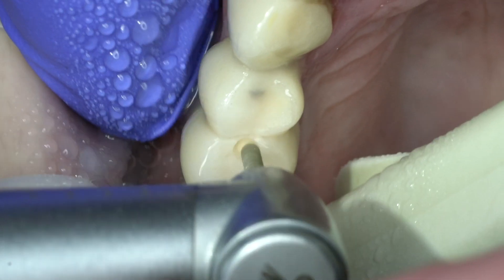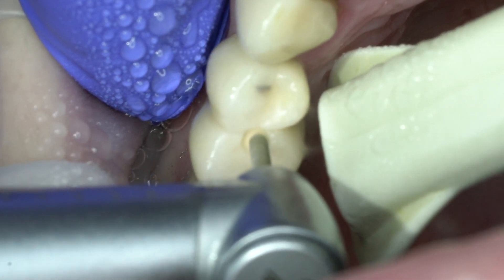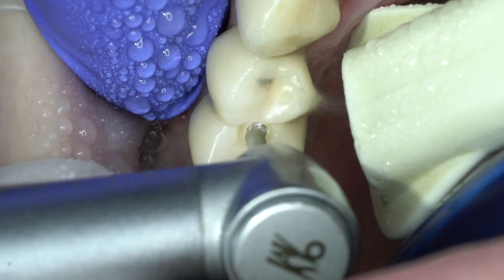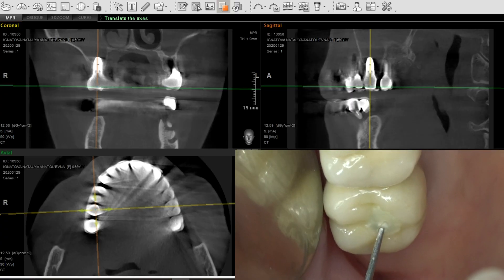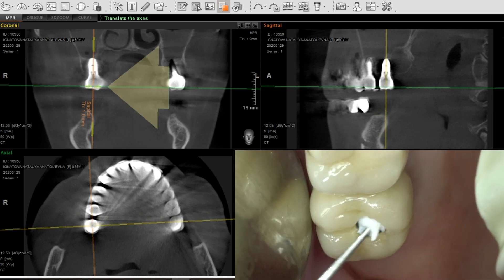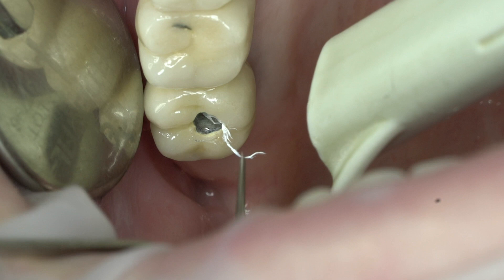The occlusal plane will indicate the starting point of drilling. The simplest situation is disassembly of an implant in which the axis coincides with the axis of the crown, and the projection extends to the middle of the occlusal plane. In this case, it is not difficult to provide space for the complete unscrewing of the screw.